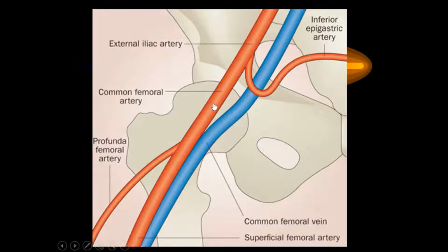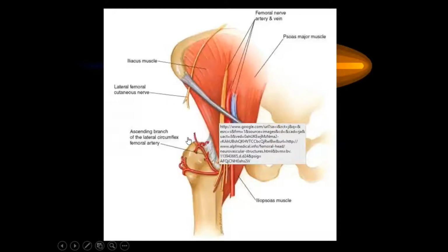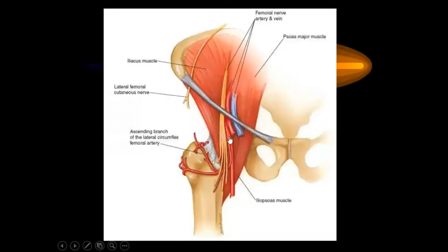So somewhere here, literally overlaying the femoral head. Looking at this, if you puncture where you need to puncture, subsequent to the procedure, once you try and achieve hemostasis by direct pressure, you can compress the vessel over the femoral head, because that's where you need to be.